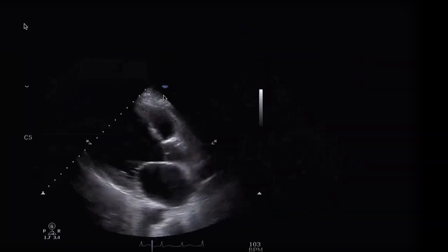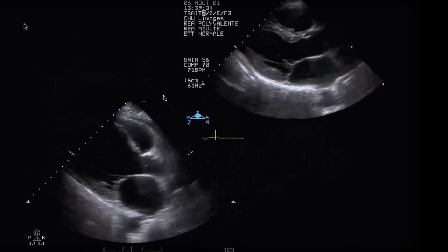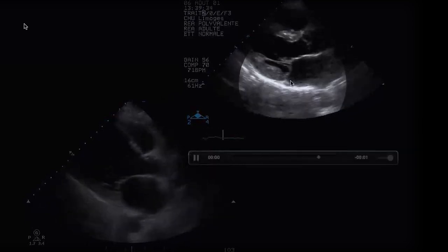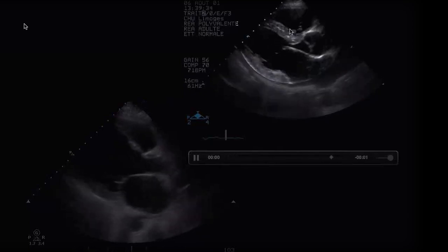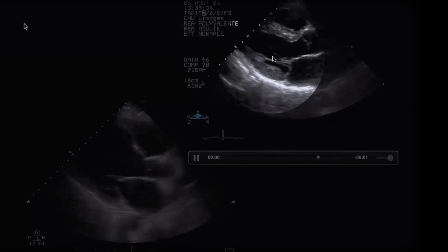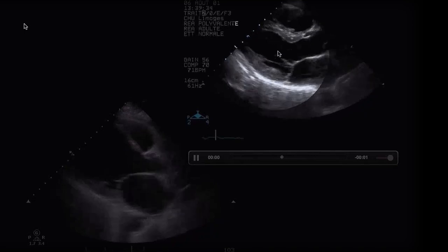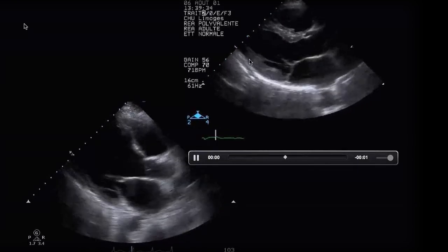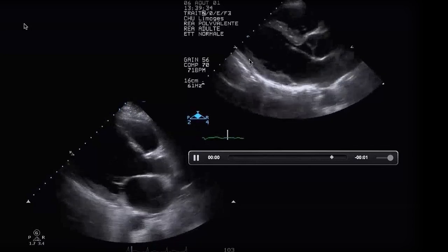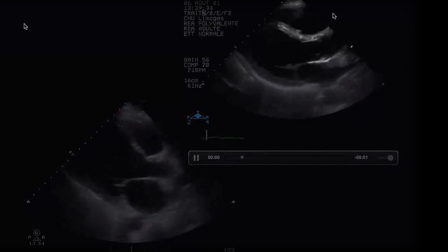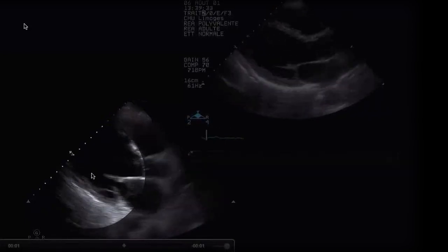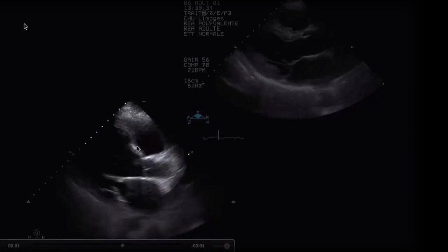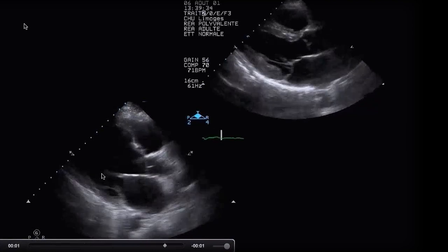Comparing to a normal image: the ventricle in normal shortens from diastole to systole by more than a quarter and less than a half — that's fractional shortening reflecting normal LV function. Looking at our patient, this heart is shortening by much less than a quarter — probably not even 10% — suggesting severely impaired function at the base of the heart.